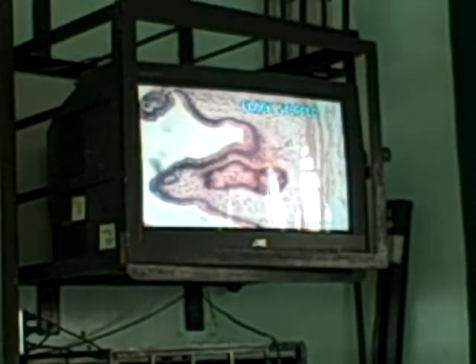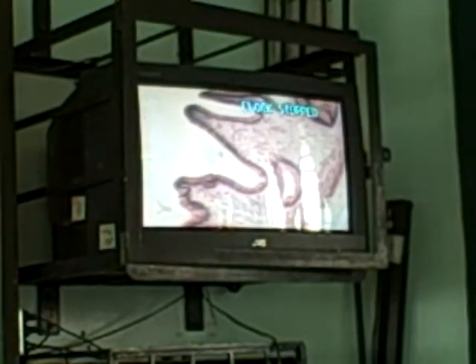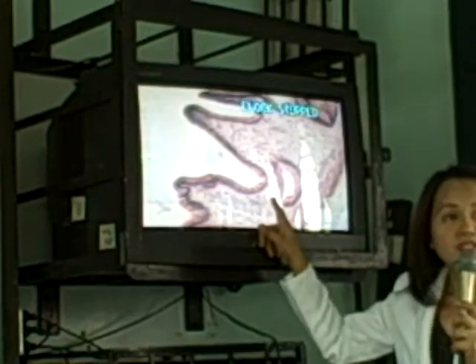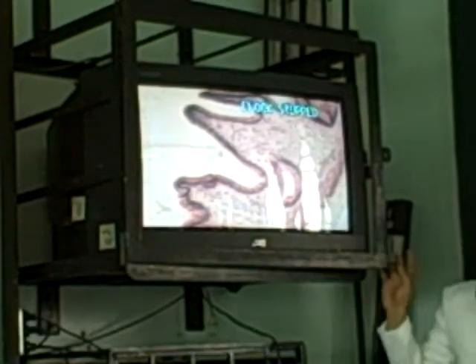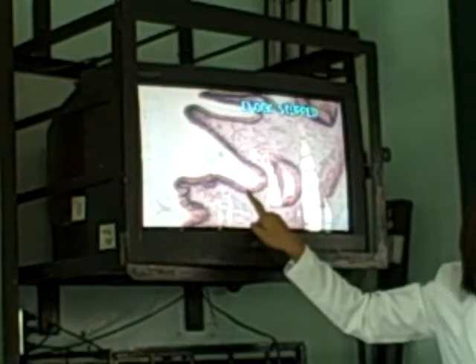Doc, excuse me, would you please go back and show us again the RA sinus? That is a sample of your RA sinus. It's an invagination or crypt. When you identify an RA sinus, it is just an invagination of your mucosa. That's why the lining epithelium is similar to the surface epithelium.